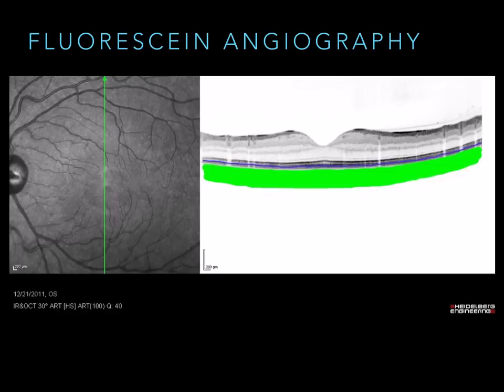Basically where the RPE is, the zonulae occludentes, if that's the way to say it, provide that outer blood retinal barrier and keep the fluorescein from coming forward. But also, fluorescein does not fluoresce brightly through the RPE because of its wavelength. So you get this kind of mild fluorescence that you would see normally. Okay, and then the fluorescein is also constrained within all the retinal blood vessels. So choriocapillaris has fenestrations, leaks out the fluorescein all the way through, generally speaking, whereas the retinal vasculature, those pericytes and that endothelium really block that fluorescein from getting out.